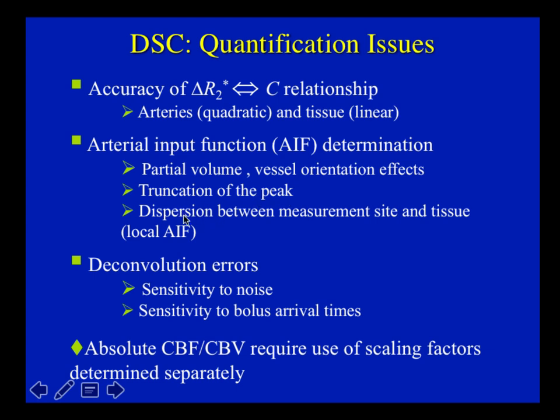And another problem is that the arterial input function, where we measure it, may not be the arterial input function that is strictly applicable to the tissue that we are looking at, because there is some dispersion when the blood moves from one location to another.